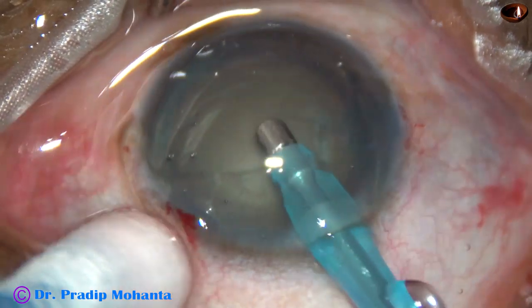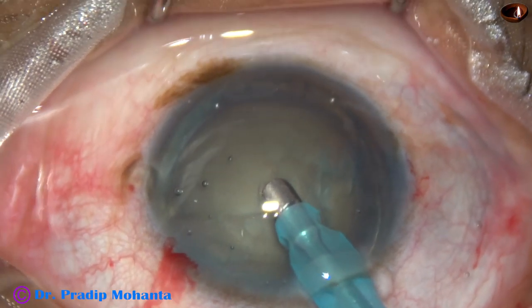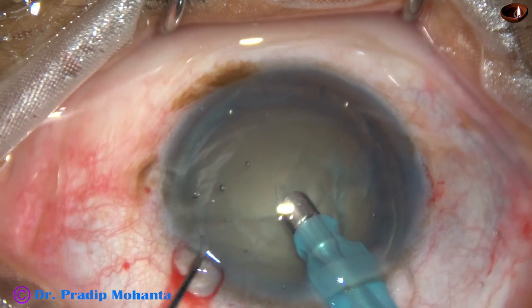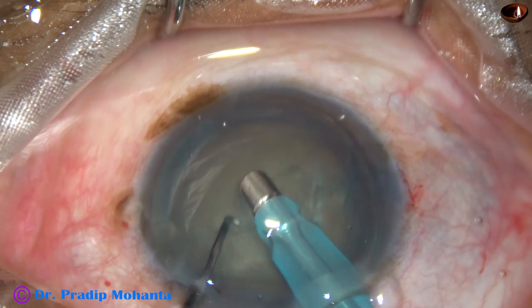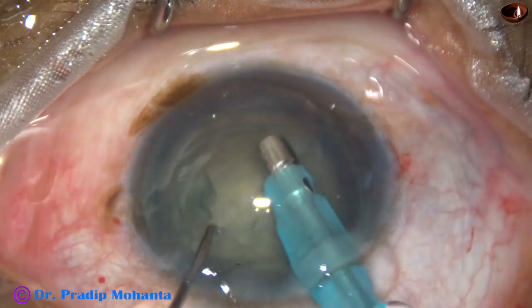After rhexis and hydrodissection, the tip of the phaco handpiece has been introduced into the anterior chamber. And now some superficial cortical lens matter is being removed. This will increase visibility.